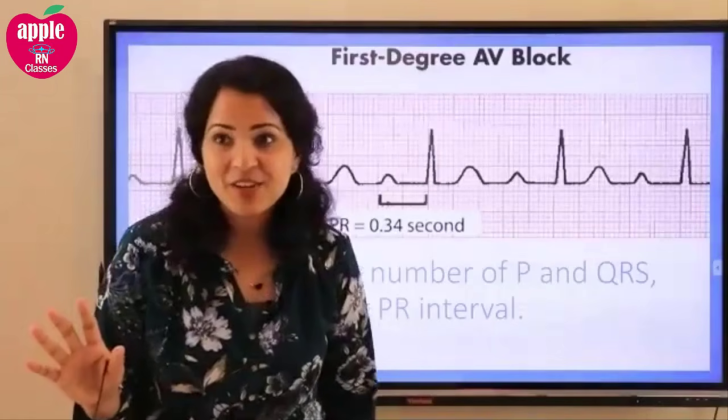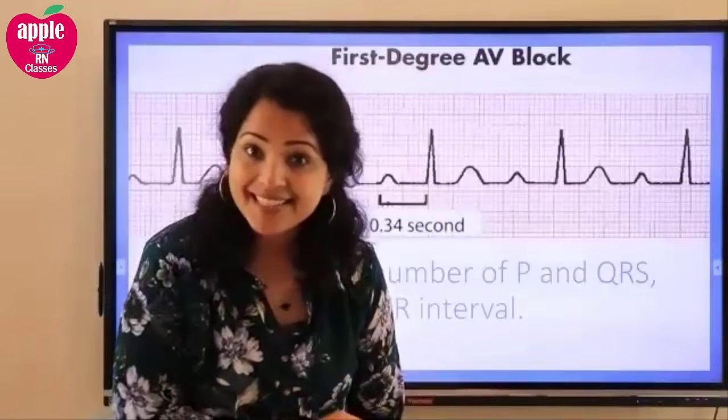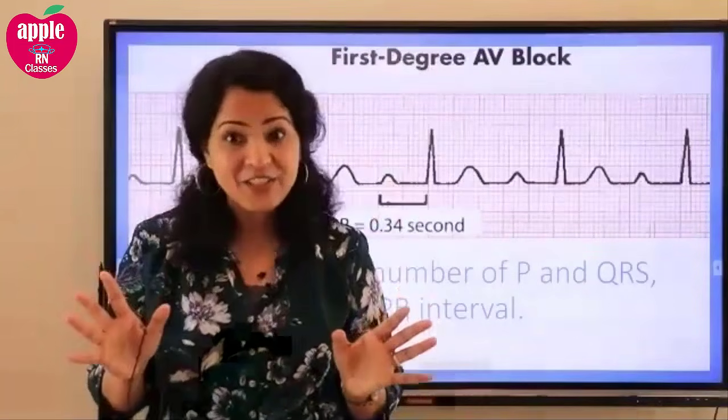Is that clear to everybody? First degree AV block. We will do more examples later and then we will figure it out, but I think it's at least clear to you, right?